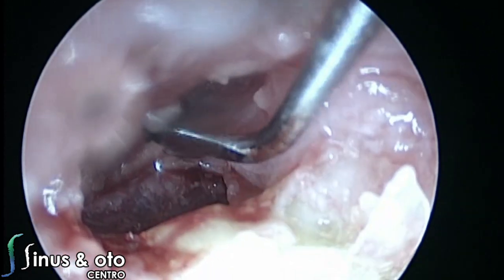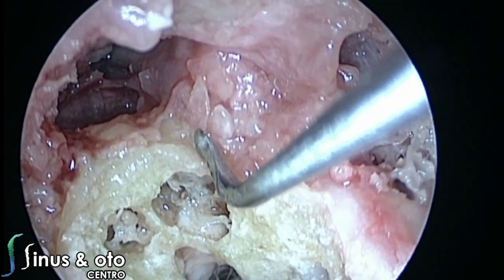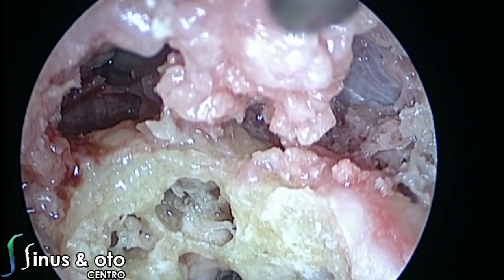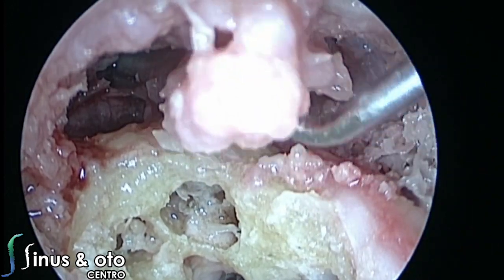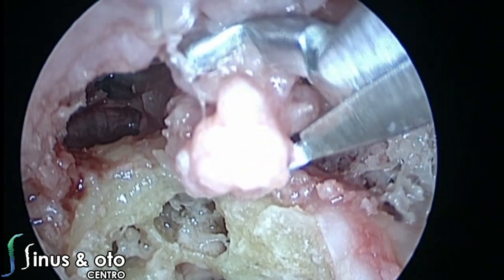because just above a little bit is the region where the internal carotid artery goes in a horizontal way, and then it goes directly to the sphenoid sinus, and then the carotid artery goes up in a vertical way, the paraclival carotid artery. So it's very nice. So you see the dura, you see a whole 360-degree view of the anatomy from the most anterior part in the internal carotid artery, eustachian tube, canal of the muscle.